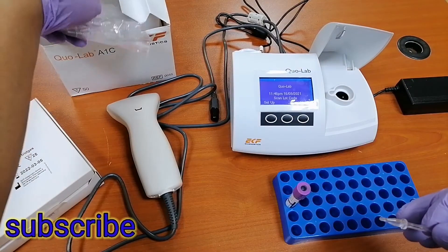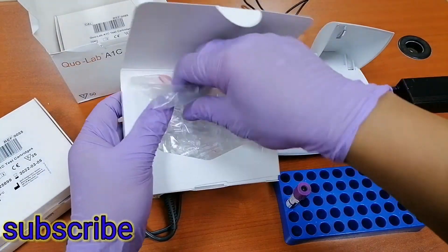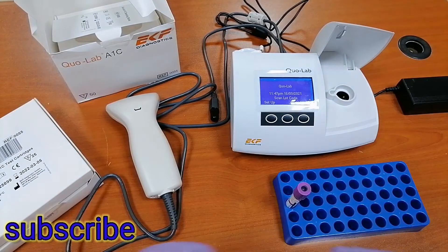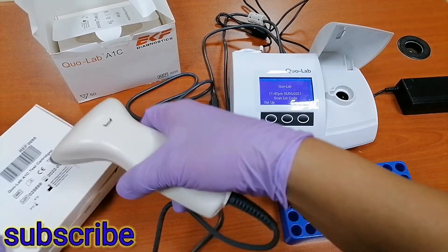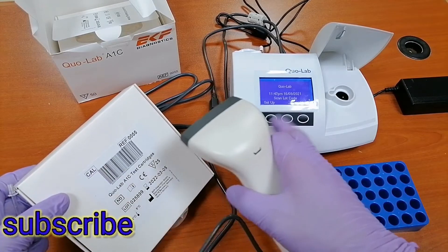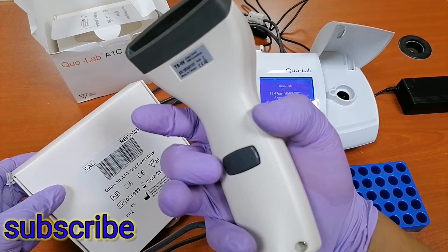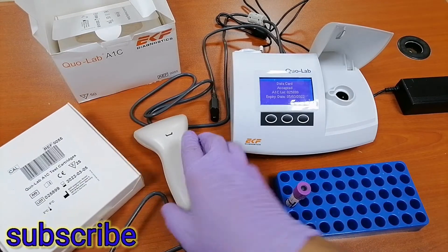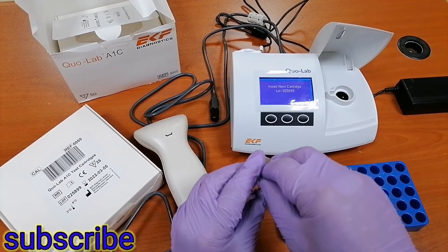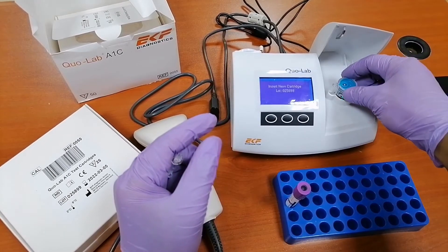So we will start. First, as you can see here, there is 'CAL' for calibration of the machine. Just place the barcode reader and then press this one and reread it again. As you can see, 'Data accepted.' And then we'll remove this cartridge and place this cartridge in this slot.